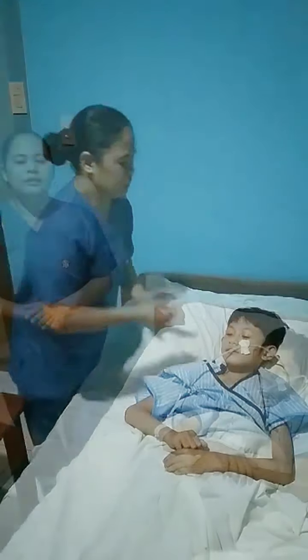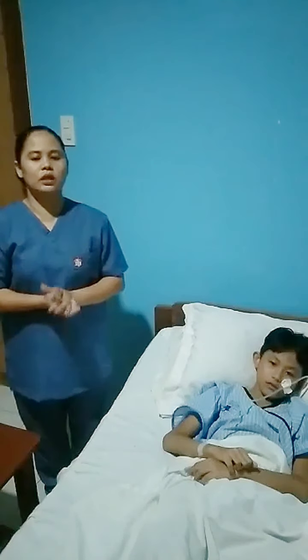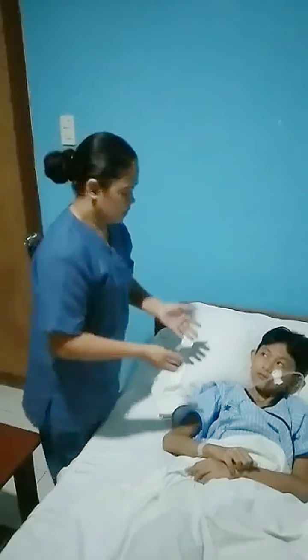Good. Next is to place the patient in semi-Fowler's position. Placing the patient in semi-Fowler's position will allow gravity to aid us during the feeding. Sir, I will put you in semi-Fowler's position.